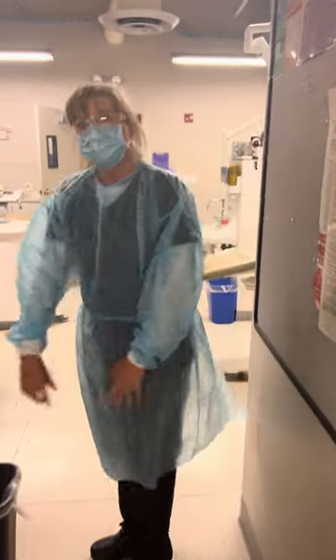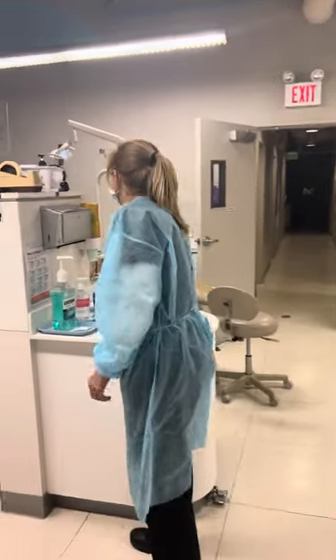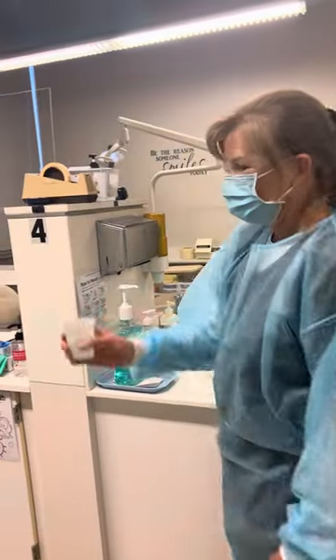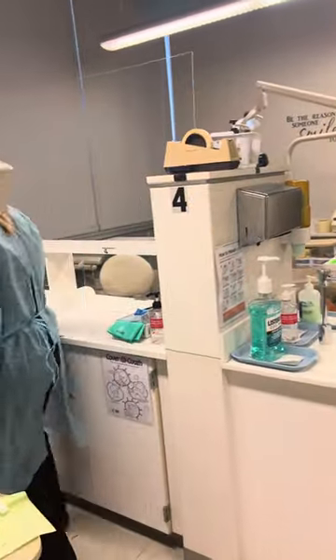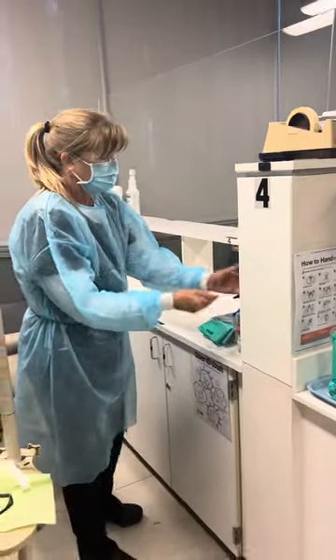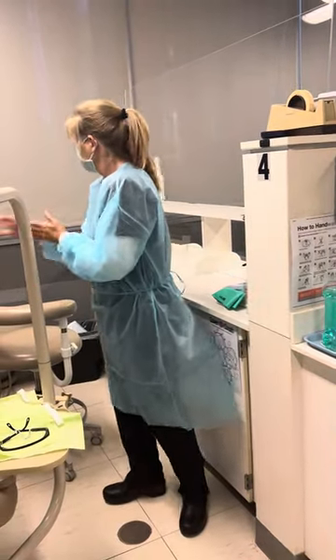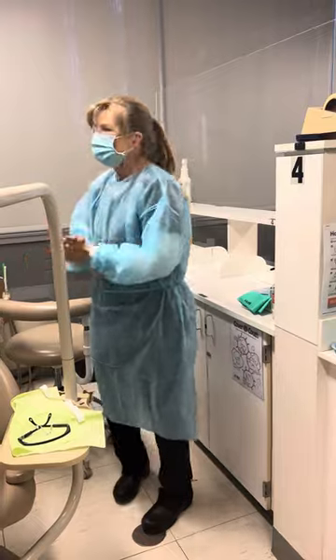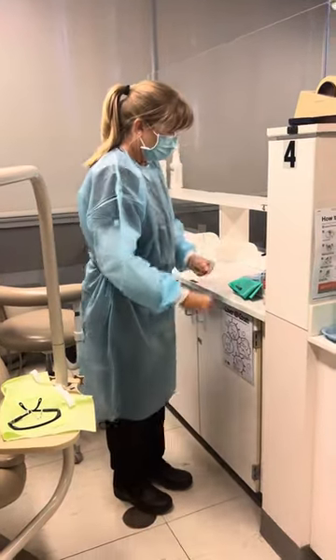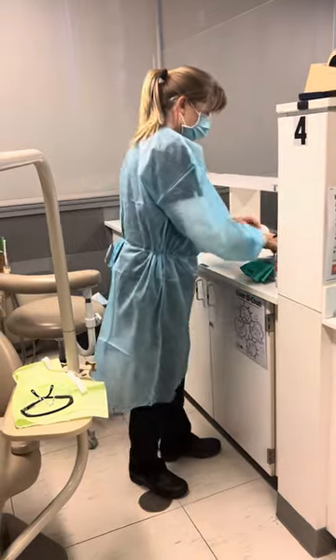Professor Monk just released her patient and she's coming back to grab a cup for the water lines. She'll put it in an area where she can grab it, then do hand hygiene. Now we're going to break down the room, so she's going to glove up because this is contaminated — we just saw a patient and we don't want to touch anything without gloves on.